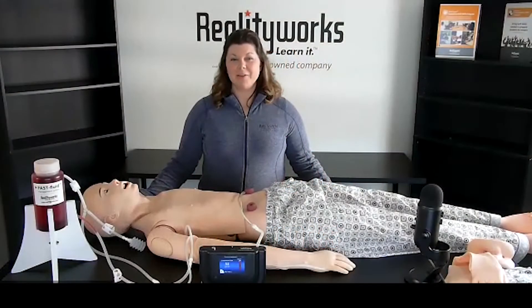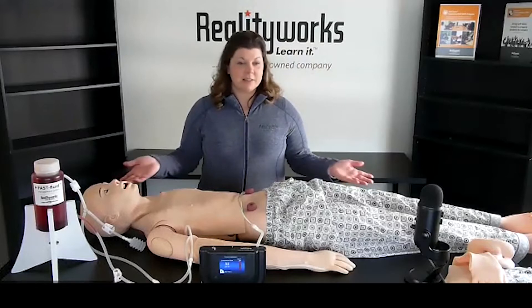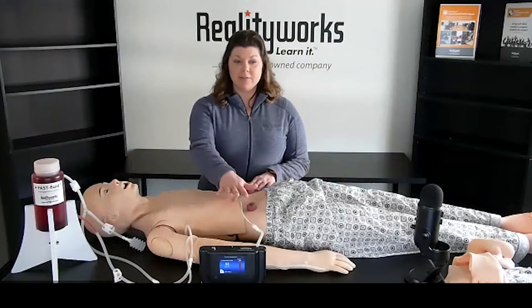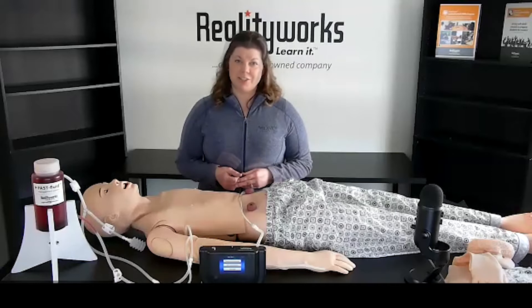Hi, I'm here to talk about the RealityWorks award-winning adult nursing mannequin. This simulator can be used in common classes including basic nursing and certified nursing assistant. This life-size mannequin also meets current American Heart Association CPR guidelines. It includes a feedback device that provides directed specific real-time coaching on the rate and depth of chest compressions.